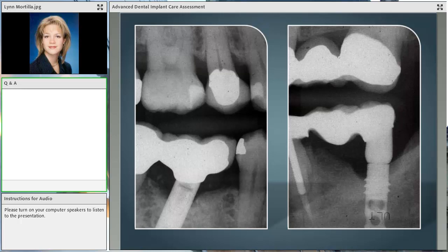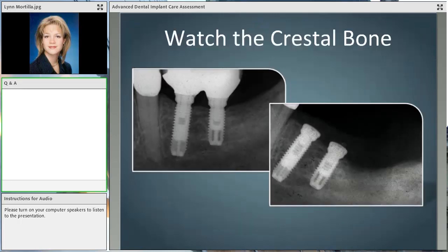Here on the right side, we can see again, we've tried to connect teeth and implants, and boy, did that tooth give up. We can also see right here a very small spacing between the abutment and the implant. So these are assessment things that definitely need to be raising some flags in your head, and documentation of these issues is also critically important.